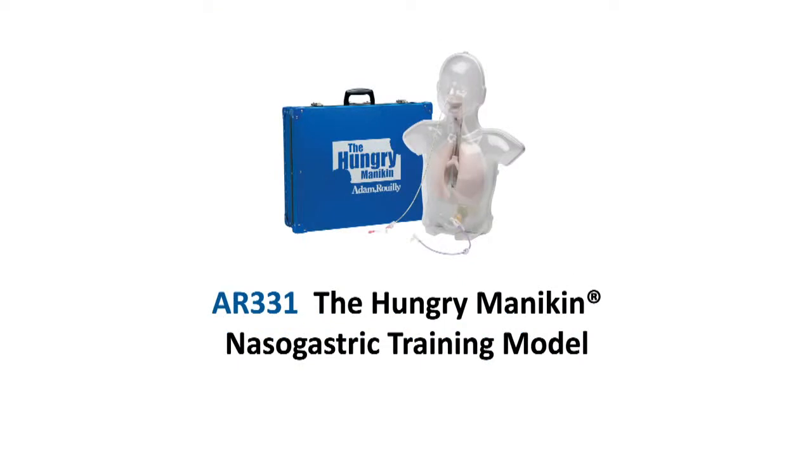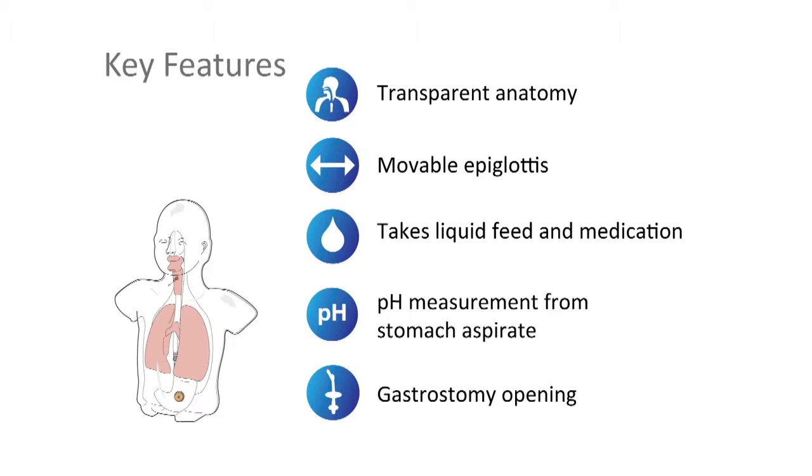The award-winning and best-selling Adam Rooley AR331 Hungry Mannequin was designed by nutrition nurses at Birmingham Children's Hospital to demonstrate to parents and carers the technique for inserting nasogastric and gastrostomy tubes in children.